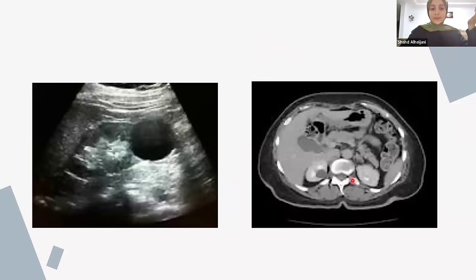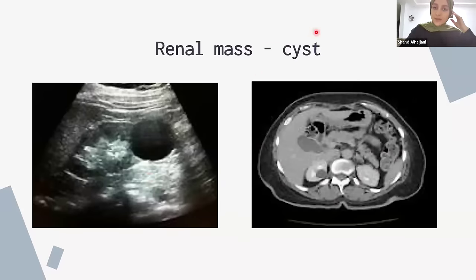But in this case, you see you have something dark, and then behind that you have posterior enhancement. And when you take ultrasound, you'll understand this in better detail, but this is basically a cyst. So a cyst is a collection of fluid. So you have something full of fluid, and when you use the ultrasound, the fluid will give you an enhancement behind it. So a cyst will have posterior enhancement, while the kidney stone will have posterior shadowing. So here you can see the cyst again. This is the cyst on ultrasound, you can see it with posterior enhancement.